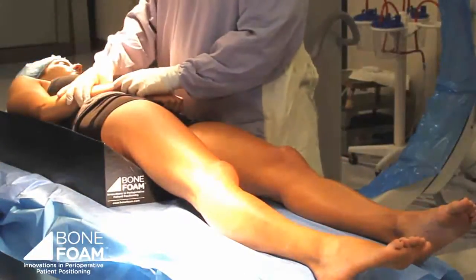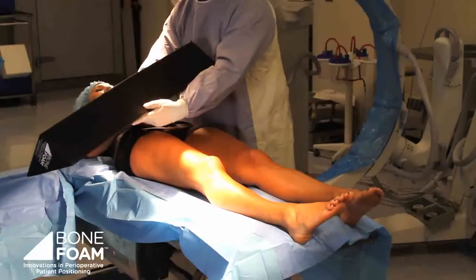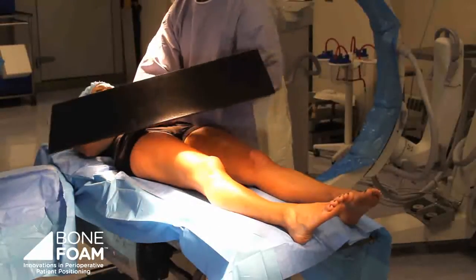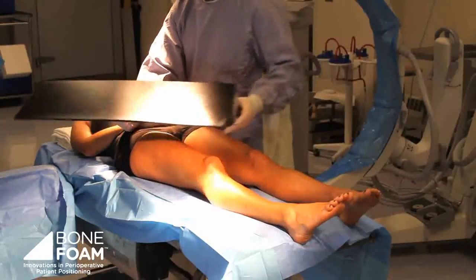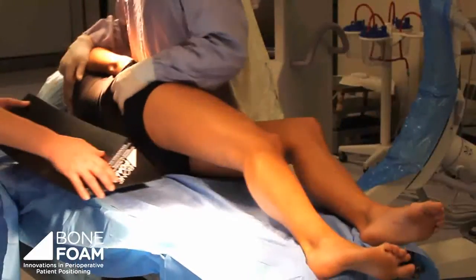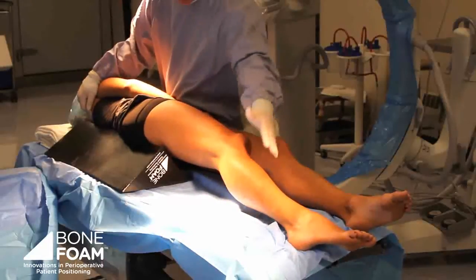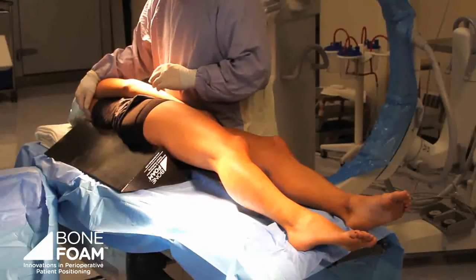Now, you can see how this is designed in such a way as to allow for two angles. If you want to bump the patient up at a very sharp angle, you put them against this surface. If you want to bump them up at a more gradual angle, you put them at this surface. So I will simply tip her up to the more acute angle in case we want to internally rotate the patient more. Depending on the patient's leg and hip alignment rotation, one might want to take advantage of this different angle.